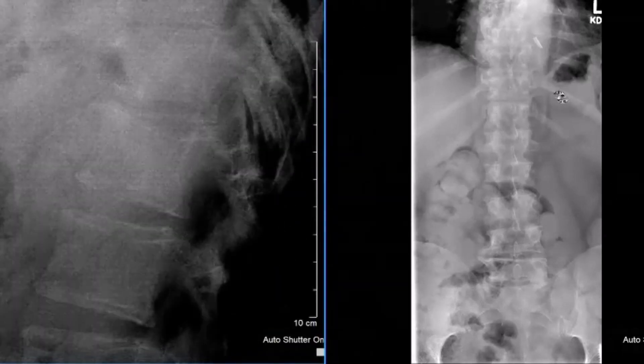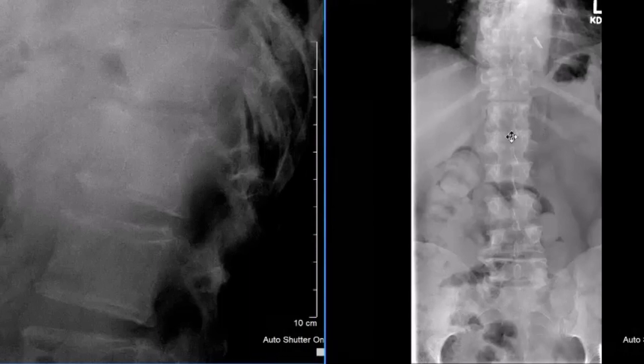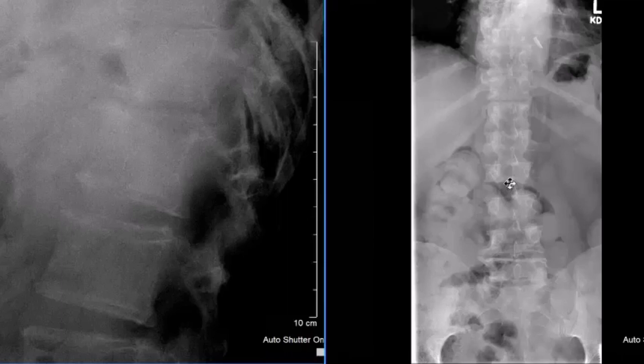The soft tissue abnormality and the loss of the end plates suggest that this could be an infectious process, such as discitis and osteomyelitis with an abscess. A history of fever and severe pain would be supportive. In this case, we need to get more imaging — MRI is probably the best way to go. This needs to be called into the emergency department, and it's a priority acuity rank three.